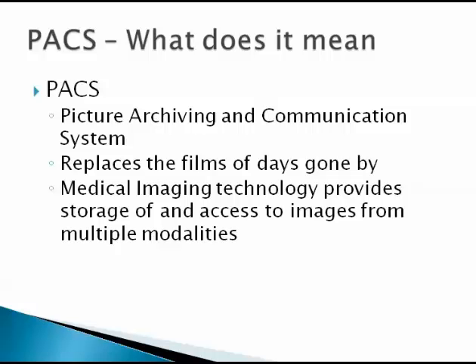PACS is actually an acronym. It stands for Picture Archiving and Communication System. It replaces the films of days gone by. Medical imaging technology provides storage of and access to images from multiple modalities. So, in other words, everything's very digitized now. In the old days, they took x-rays and you put them up to a light and you carried them. No more. Now they're still doing an x-ray, but it's going into and being stored in a PACS machine.